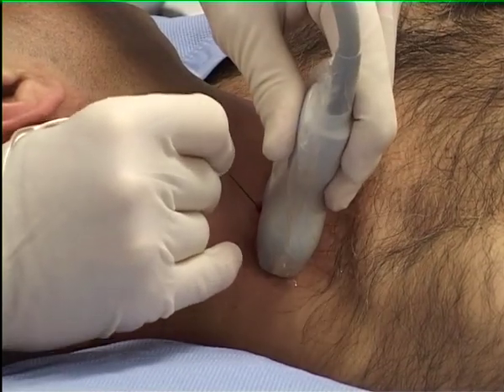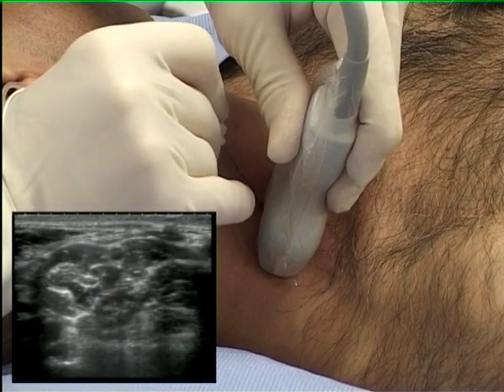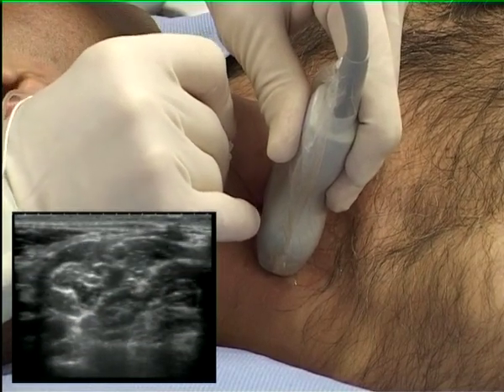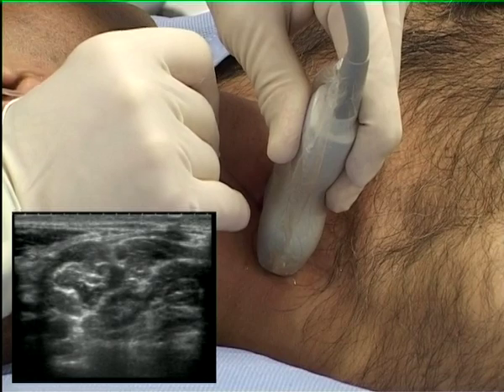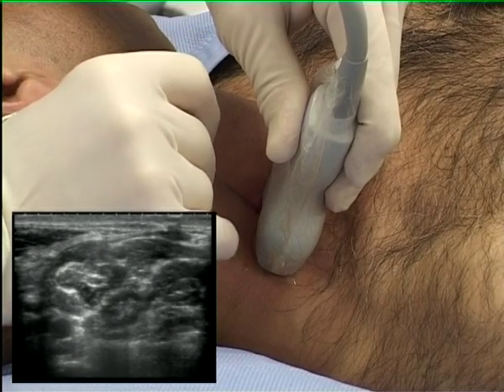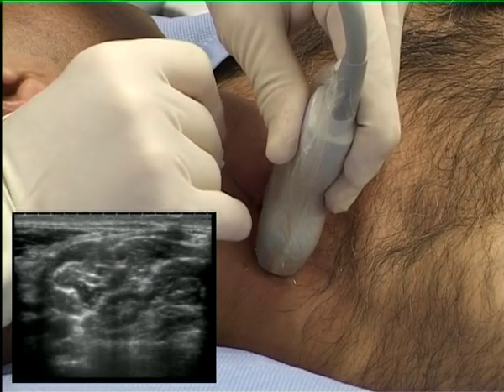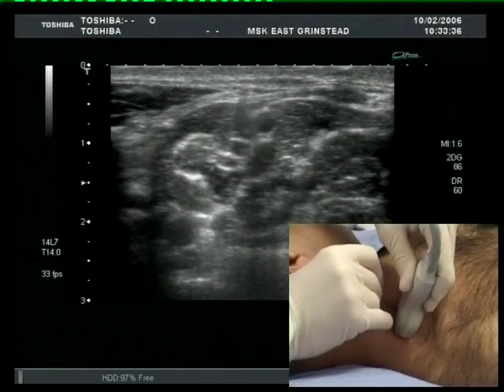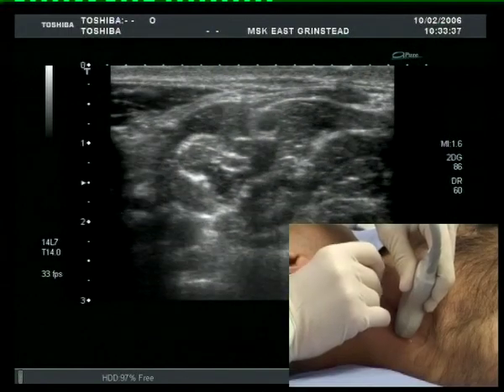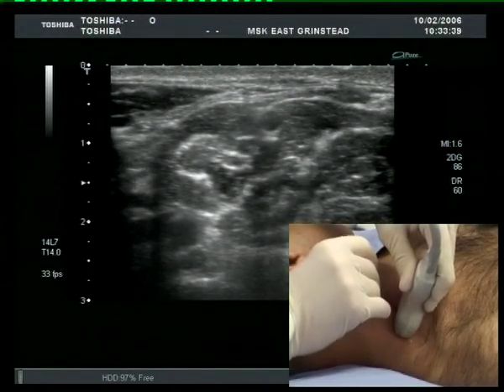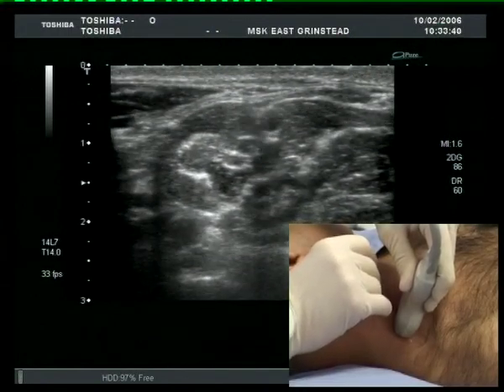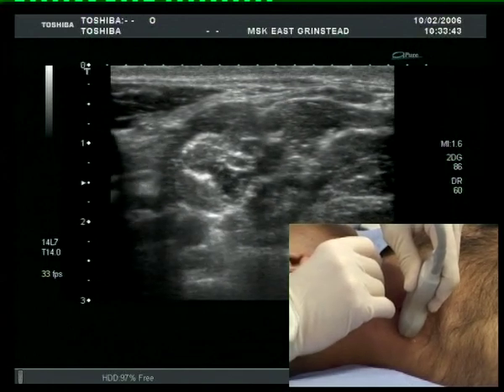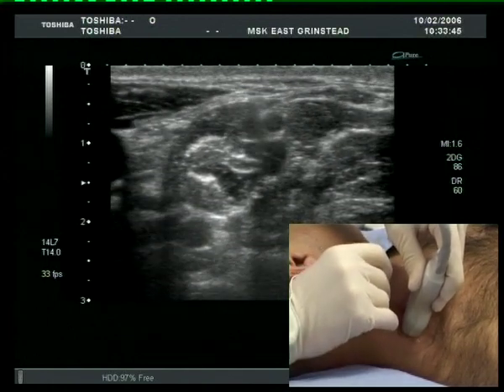Small bouncing movements of the needle tip cause tissue displacement and aid needle tip visualization. The needle is gently advanced anterior to the roots, with the aim to place the needle near C5 and C6.